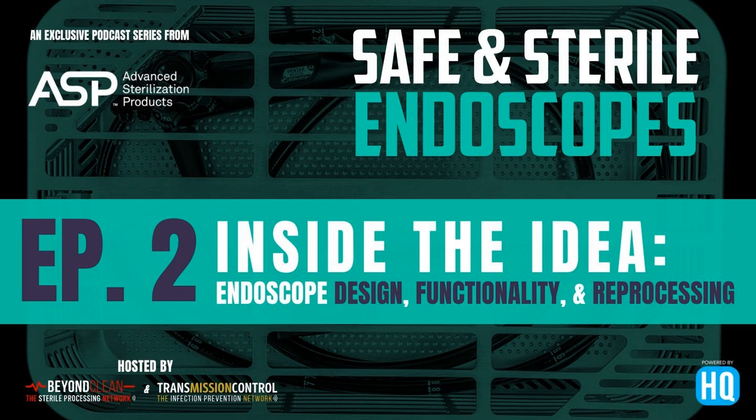Well, what we know right now is that the scopes that are specifically made for terminal sterilization, like the ones that Tamara mentioned with the half moon on them, are made specifically to withstand 100, 200 cycles in STERRAD. So that has been worked out with the MDM in partnering with us to make sure that the lifespan of these scopes are durable and are functional within their lifetime.